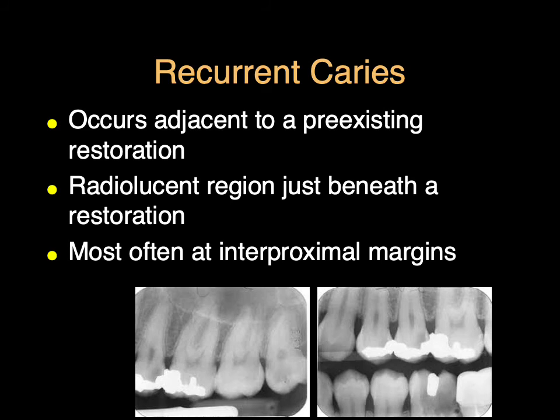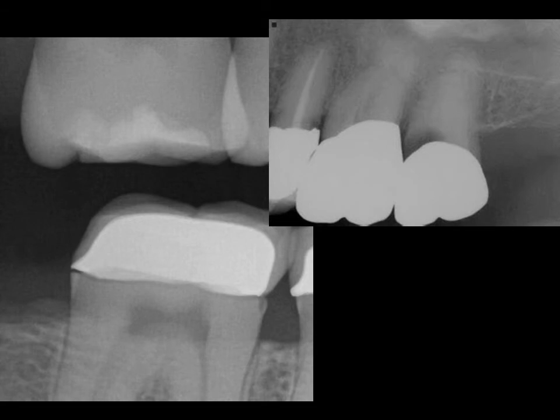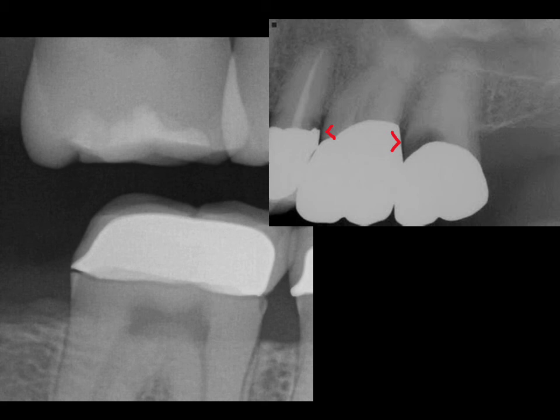Looking at this bite wing, there's recurrent decay certainly around the second premolar, and around the first premolar as well. Looking at the periapical, it shows up very well in both the periapical and the bite wing. In the picture on the right, there's lots of decay around the crown margin. Even on the second premolar, there's recurrent decay around the distal margin. The mesial margin may represent cervical burnout because it looks like it stops at the crestal bone, whereas the distal doesn't extend all the way to the crestal bone, so that represents recurrent decay.